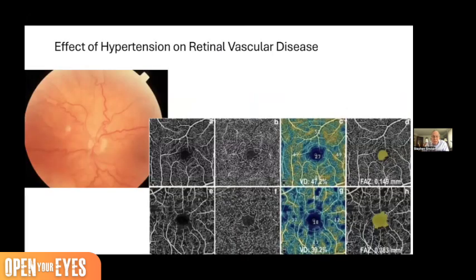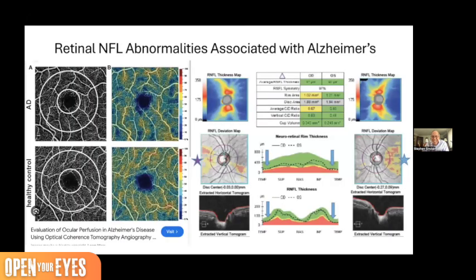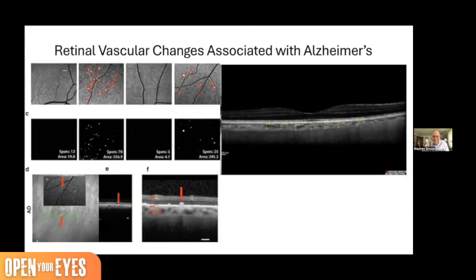But go back to that one more time, because I want to talk about this study and get your opinion on it about amyloid. There was a study done at Cedars-Sinai in Los Angeles, and they showed that amyloid plaque predicted atrophy in the hippocampus, and that the retinal amyloid correlates with cognitive scores. Now, they used a technique using a laser ophthalmoscope with curcumin to light these things up. I'd like to have your opinion on that.